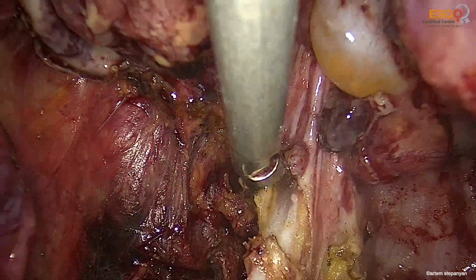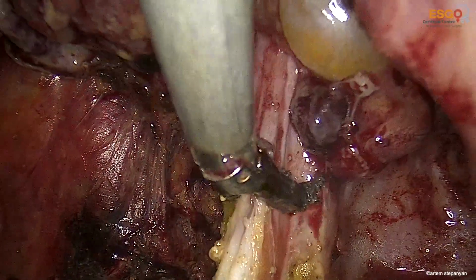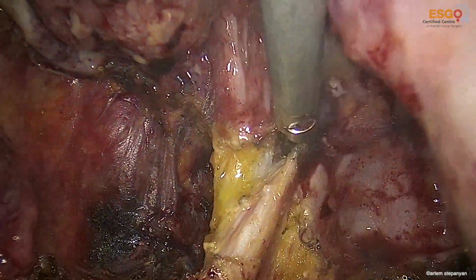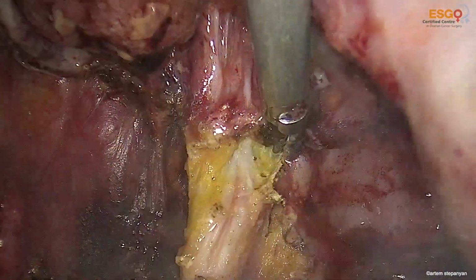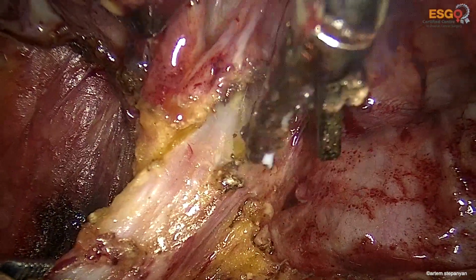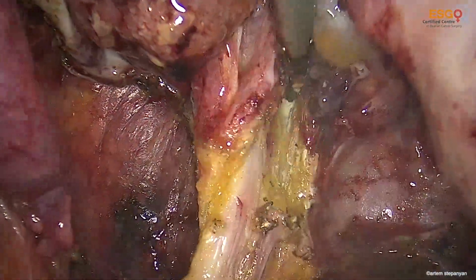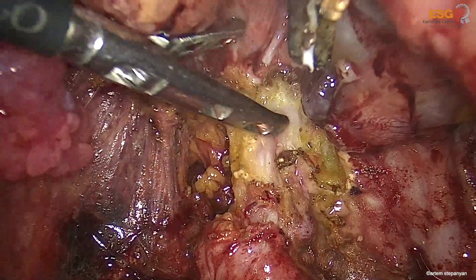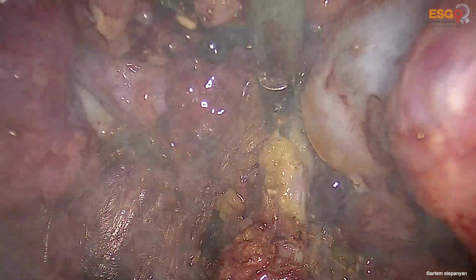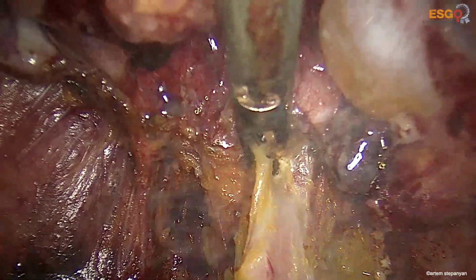And again, being close to the tubular structure, we change the bipolar to the harmonic scalpel to minimize the risk of the thermal injury of the tubular structure, particularly the rectum in this case. We see the rectum, then the peritoneum of the Douglas's pouch is cut and pulled ventrally.